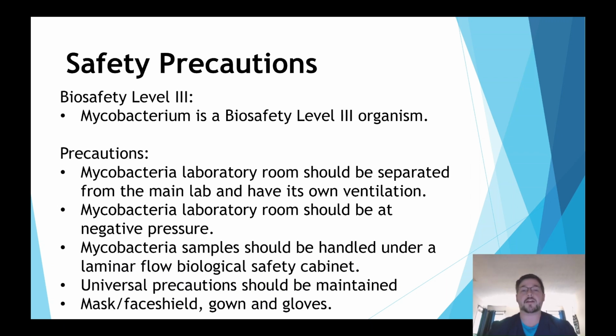The room should be negative pressure, meaning that air is able to come in, but it's not able to leave the room. Mycobacteria samples should be handled under a laminar flow biological safety cabinet. It's a level 2 biological safety cabinet. And universal precautions should be maintained. You should wear your mask and face shield, gloves, things like that.